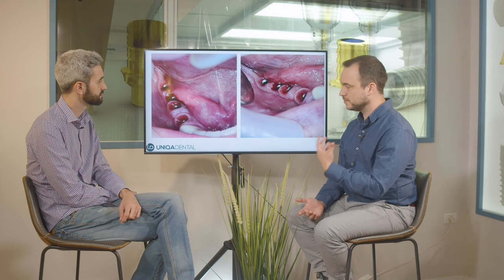We took off all the abutments. You can see that in the abutment with the thick layer of cement and the cement that was below the gingiva, you have the biggest amount of bleeding. That means the most inflamed gingiva was around this abutment.